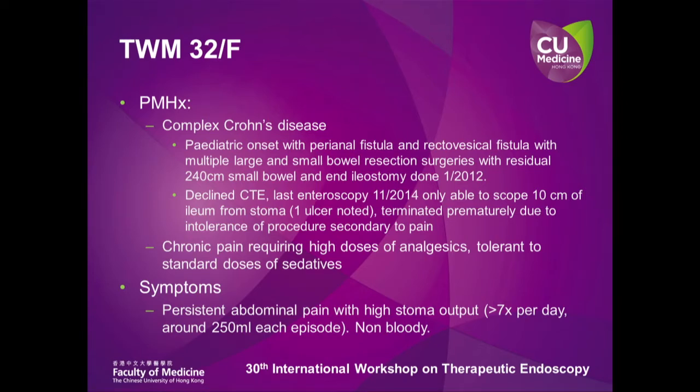She declined the CTE and last enteroscopy was in 2014 and was only able to scope to 10 cm of ileum from the stoma, and one ulcer was noted. Terminated prematurely due to the intolerance of procedure secondary to pain. The patient has chronic pain requiring high doses of analgesics, tolerance to standard dose of sedatives.